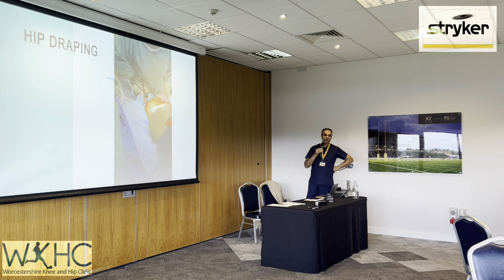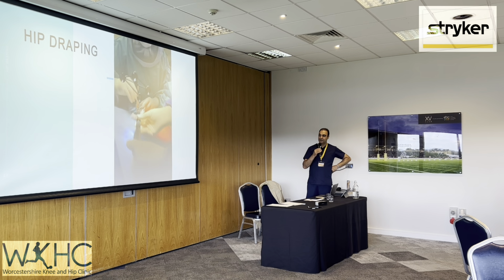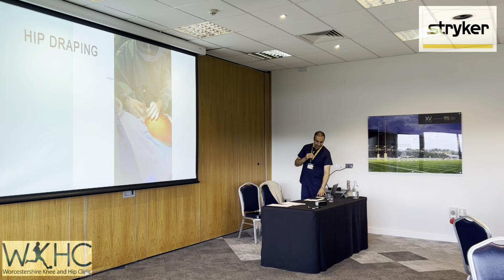So we recommend putting local anesthetic into the pins, because they can be uncomfortable. And then we tighten all those nuts to make sure they're absolutely tight. You've got to make sure those nuts are tight. When we started, there were a couple of cases where they weren't tight and it caused errors, which we then had to pinpoint to the problem, which was here.